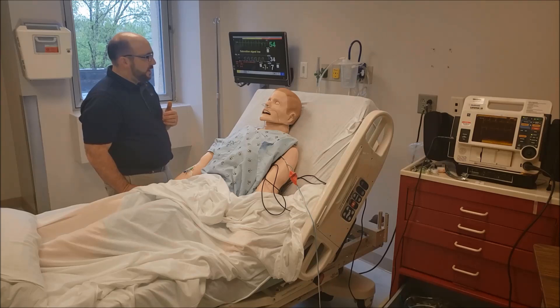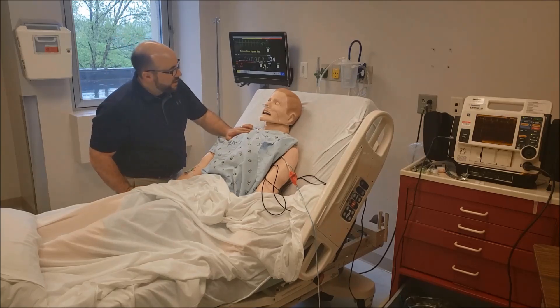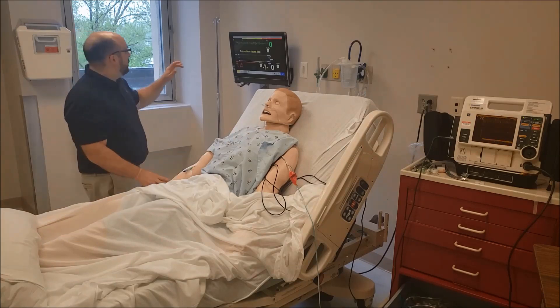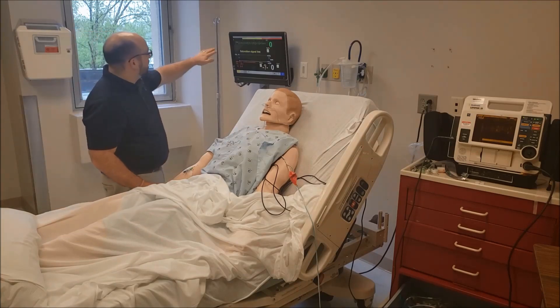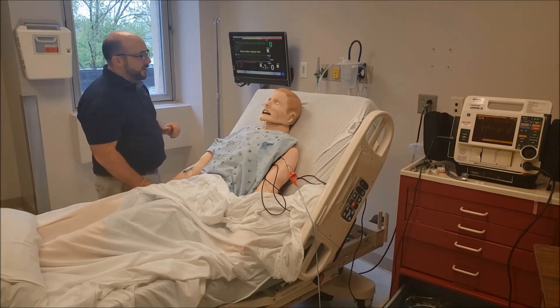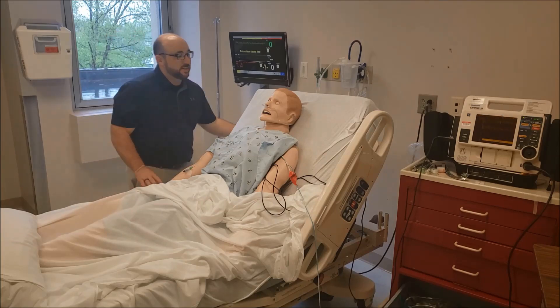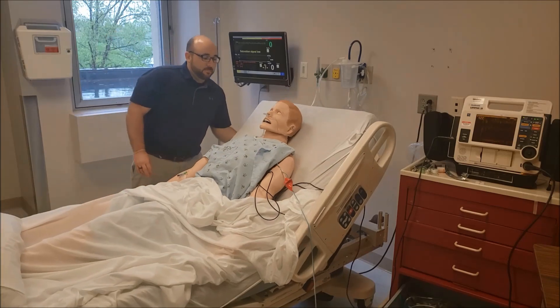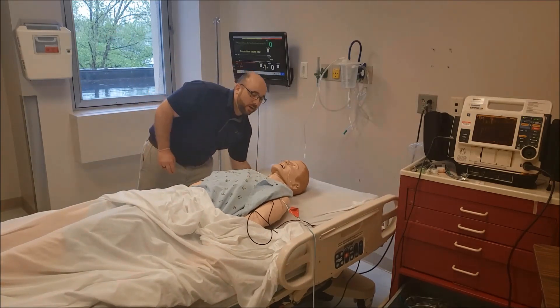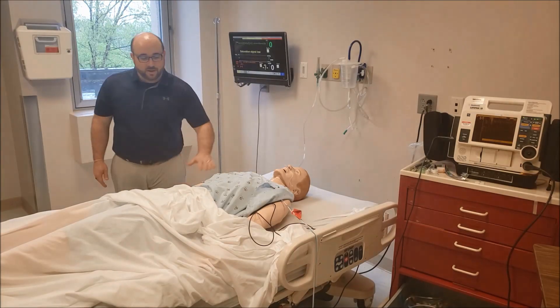Stan, Stan, Stan — shut the pacer off. We see his underlying rhythm is V-fib. We know for V-fib we need a defibrillator. Let's bring the team in — we're going to start CPR and set up the defibrillator.